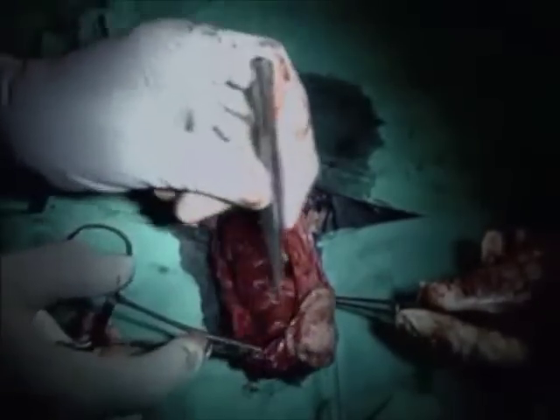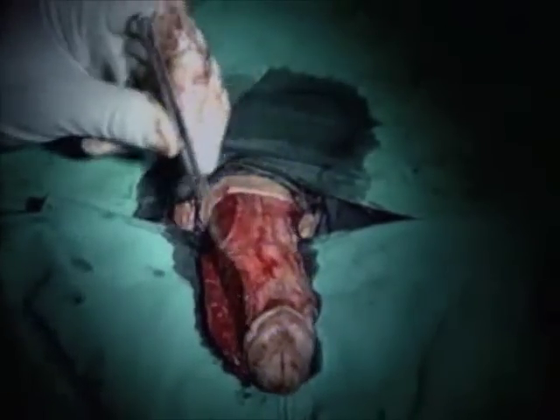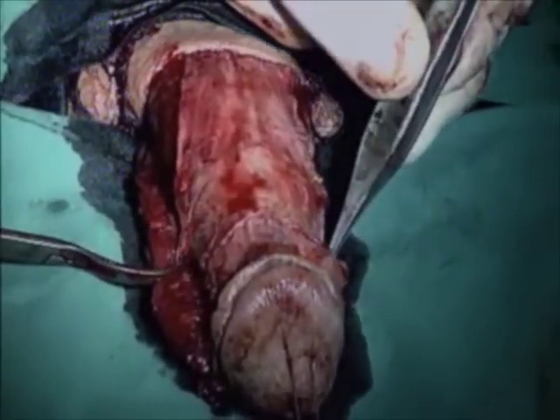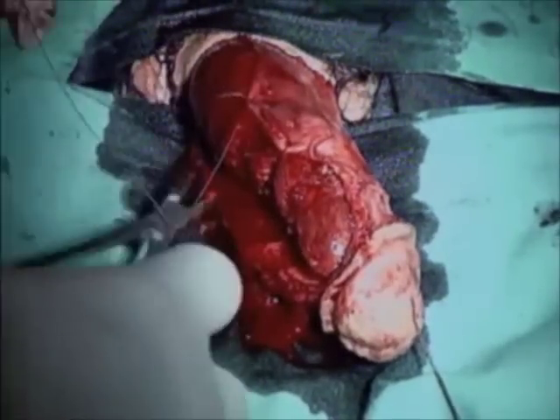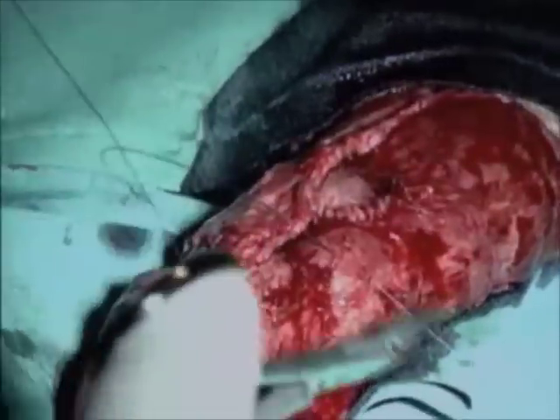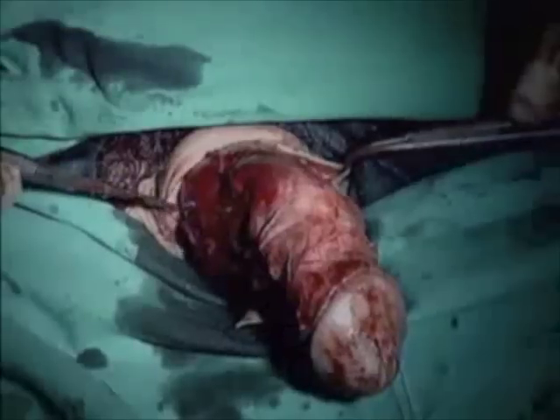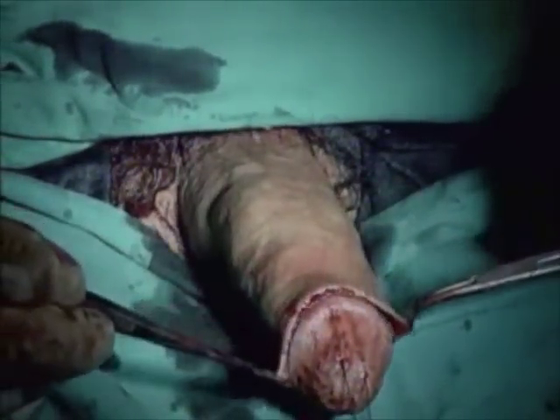Penile reassembly involves fixation of the neurovascular bundle and the urethra. The thick, strong, and wide neurovascular bundle covers the dorsal side of the penis, minimizing graft bulging. Reconstruction of penile skin is performed as in circumcision.